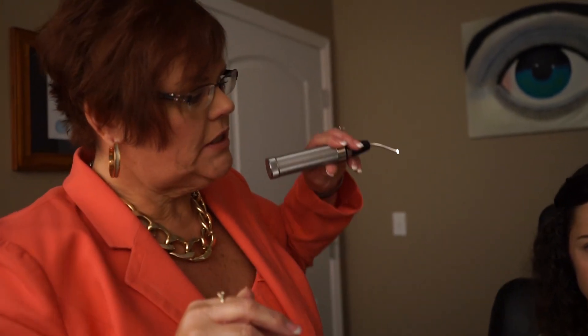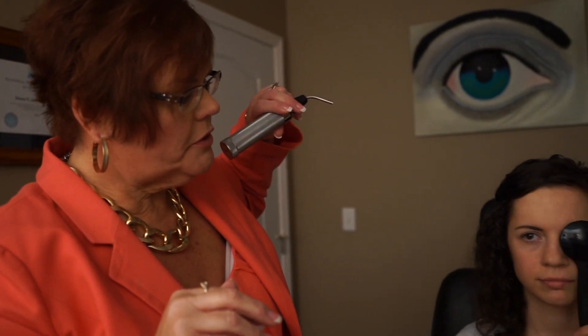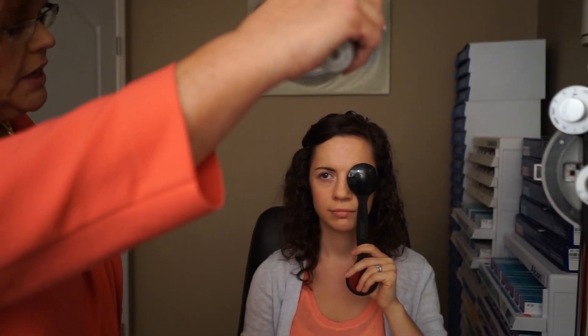Continue asking: 'Can you tell which way my hand is moving?' If she still can't see hand motion even from close distance, get your transilluminator out and project it in all four quadrants from about 15 inches away — supertemporally, inferotemporally, inferonasally, and supranasally.